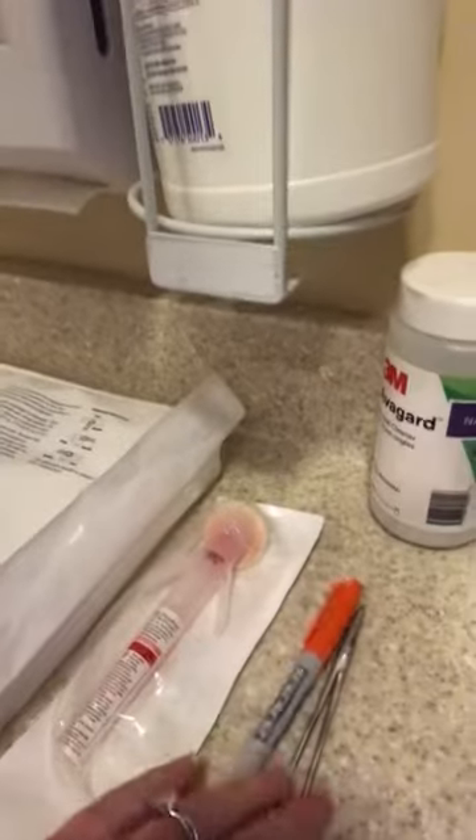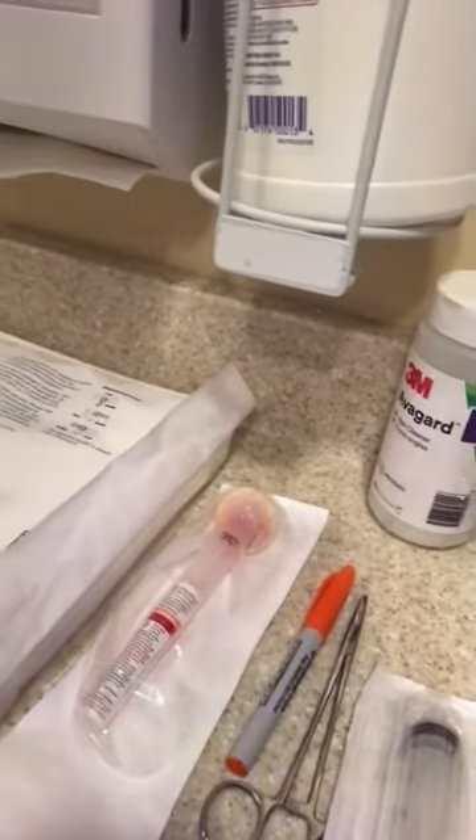This is the setup for a lumbar puncture as well as a history and explanation of the procedure. For setup we have a lumbar puncture tray, a 25 gauge needle, some alcohol prep pads, 1% lidocaine for numbing, a fluoroprep, a marker, and a hemostat for marking and sterility, plus a 10 cc syringe. All the tubes and supplies we send to lab are in the tray.